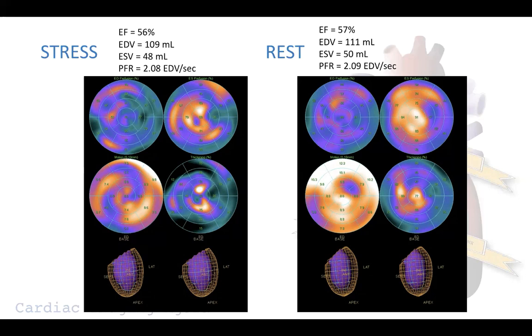So it's something that could be taken into account when you think about the risk of this patient. We have the presence of perfusion abnormalities in the LCX territory, recently associated with decrease of kinesis in the lateral wall.